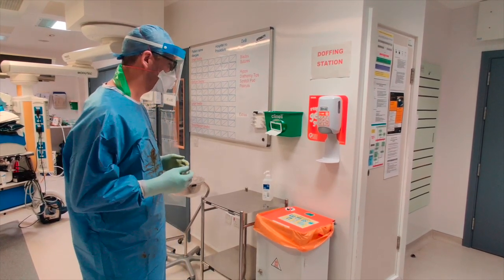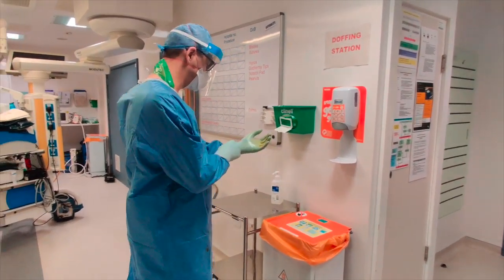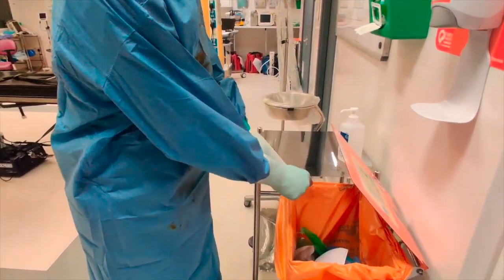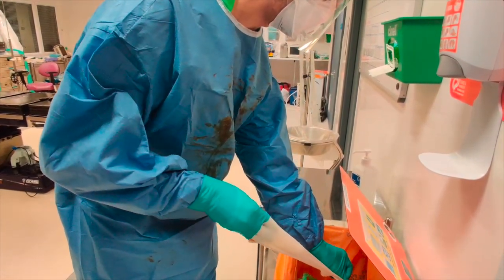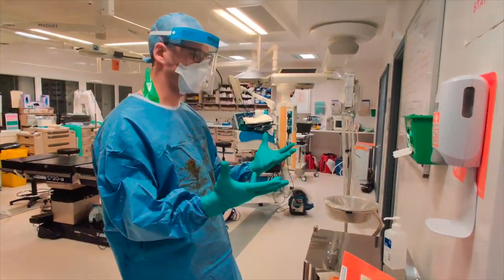The first thing I'm going to do is come to the bin and remove my outer layer of gloves. I will do this type of contamination removal and do it directly into the bin so we don't spread any virus outside the area.